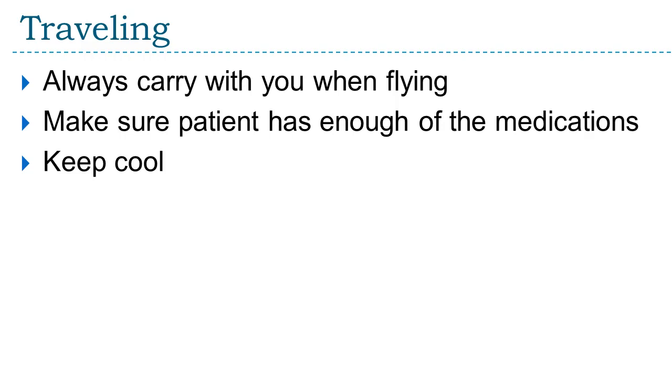As I said with these insulin pumps, it's basically an external device. It acts like a pancreas. It inserts a needle or a catheter in the subcutaneous tissue, usually in the abdomen, and we usually secure that with tape. But the thing is, these needles have to be changed every 3 days.